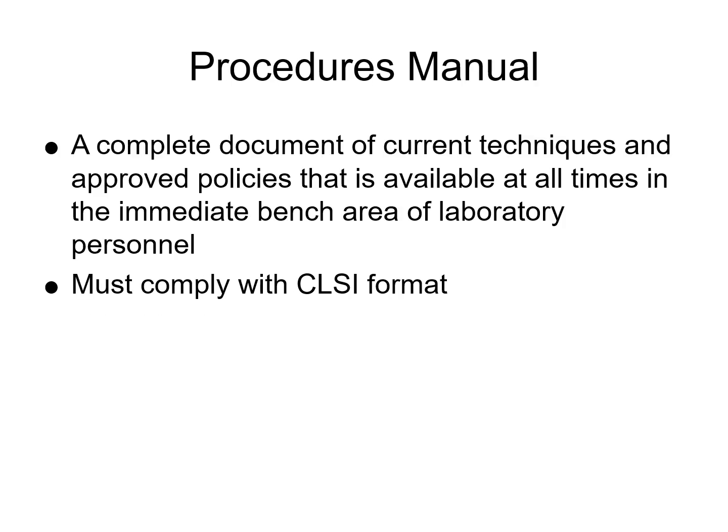All right, so the procedures manual. The purpose is to ensure laboratory personnel have immediate access to up-to-date techniques and approved policies for serology testing, or really any testing in the laboratory, but this is for serology and immunology. And also we want to maintain compliance with recognized standards like CLSI.